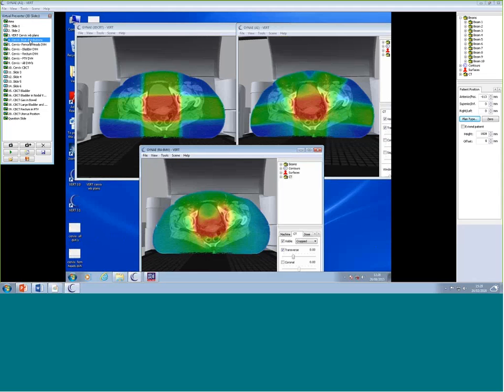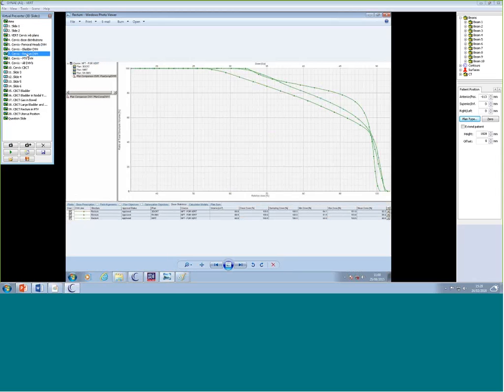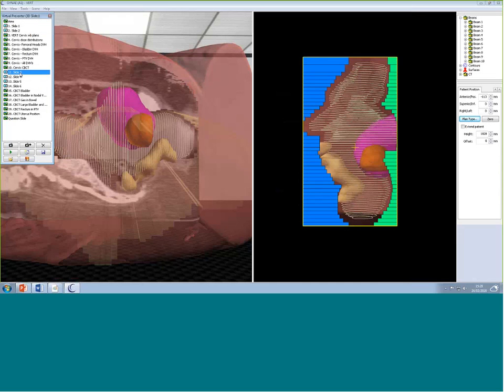You may have heard of that, to take the pictures and then put this into a PowerPoint to add it to Vert as a JPEG. And what we also did is present DVHs for each of them. With all this information, including the plans, DVHs and CBCTs, they then had to write in the workbook what the pros and cons are and which plan, critically analyze everything in conjunction with what you do in your own departments, and work out what the best plan would be. That was the idea behind producing this.